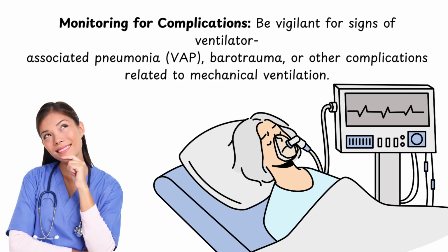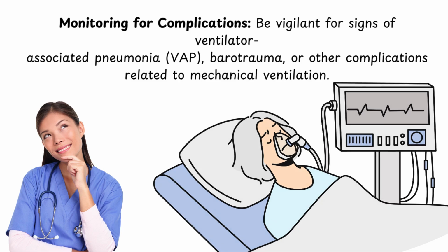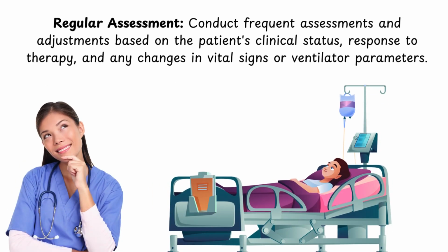Monitoring for complications. Be vigilant for signs of ventilator-associated pneumonia, VAP, barotrauma, or other complications related to mechanical ventilation. Regular assessment. Conduct frequent assessments and adjustments based on the patient's clinical status, response to therapy, and any changes in vital signs or ventilator parameters.